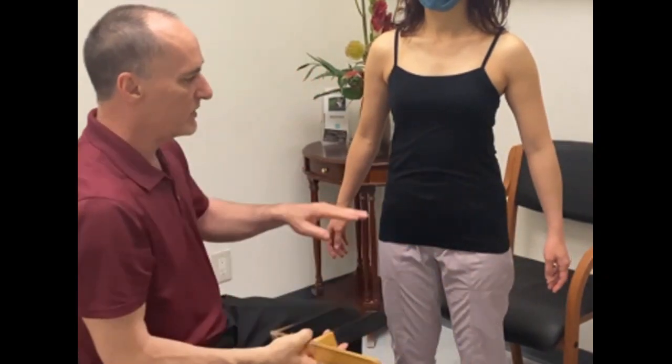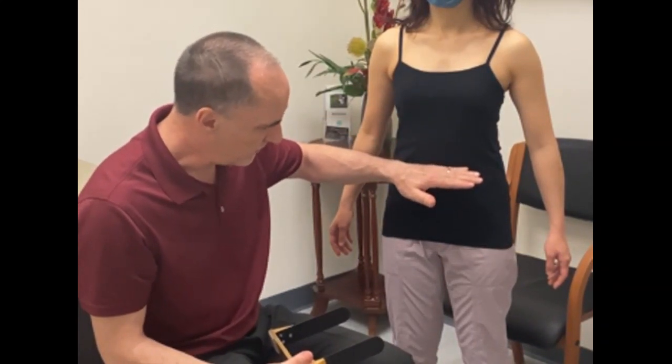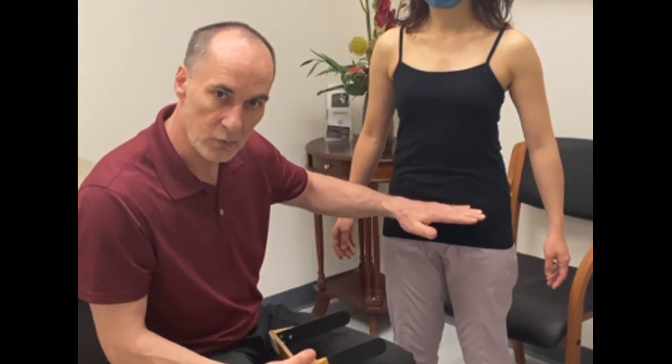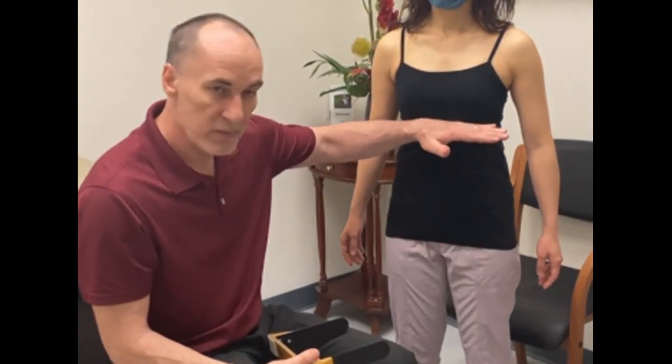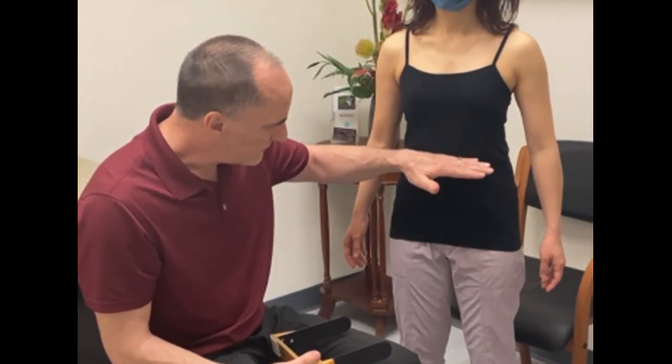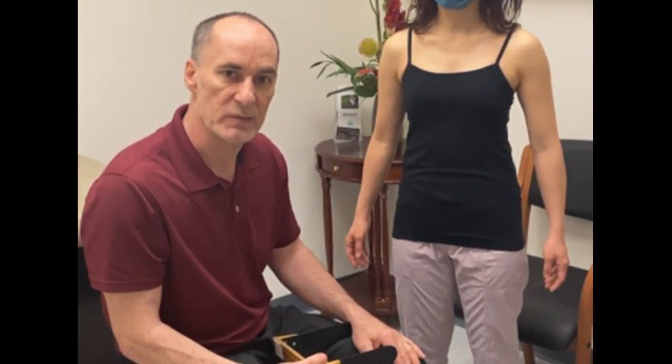Remember, your measurements should be smallest at the waist, getting bigger as you go up the body and bigger as you go lower. The biggest measurements are at the very bottom and the top — smallest at the waist, then getting bigger again as it comes down to the trochanter measurement. And that's it.